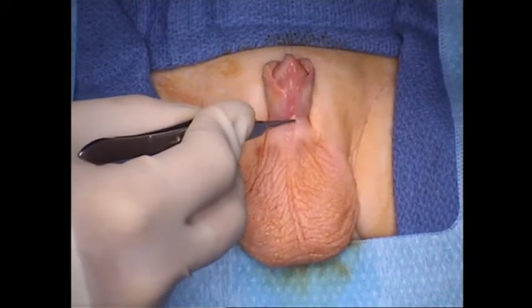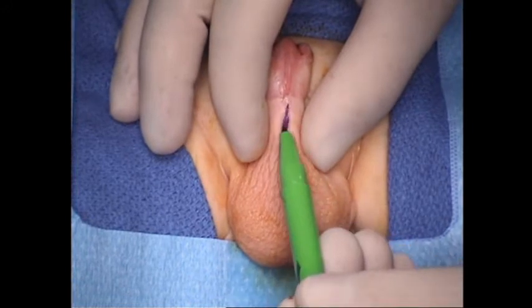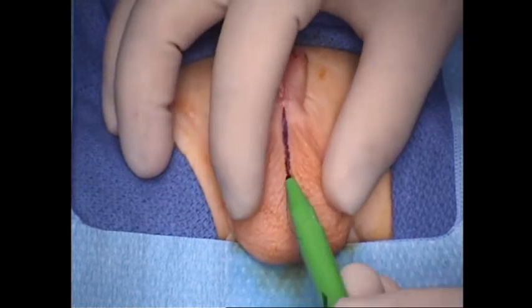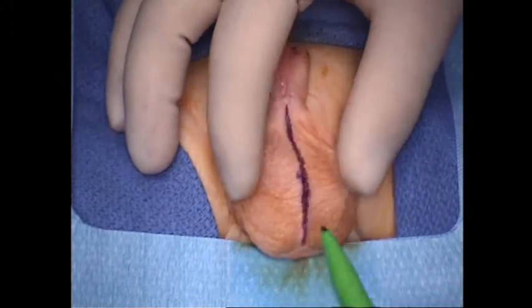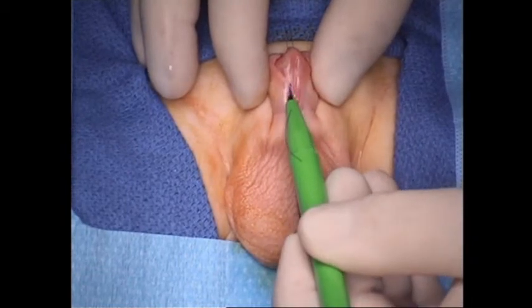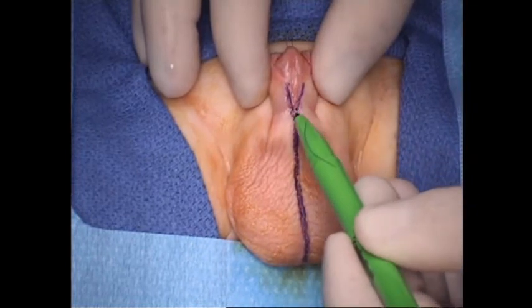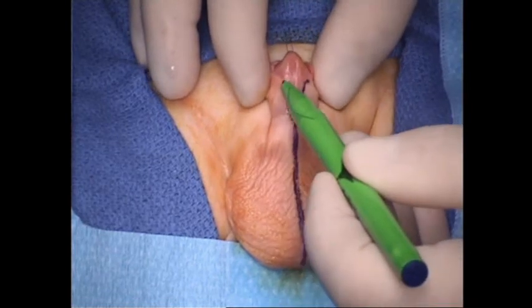So we're going to make our initial incision right down here where the skin gets a bit thicker. And we'll go ahead and extend that all the way down the midline into the scrotum because we're going to want to dissect all of the urethral tissues into an anatomically normal location. Many boys with proximal hypospadias will have a urethra that's essentially going in the wrong location in the scrotum, too anteriorly located. And so we want to normalize all of that.